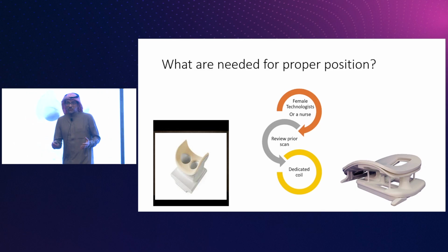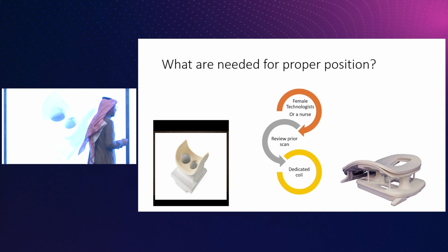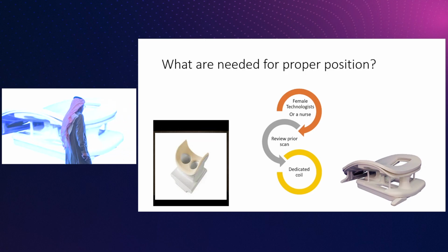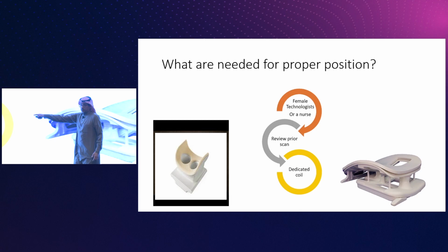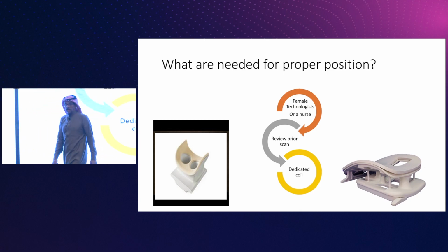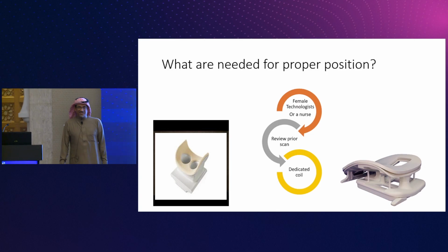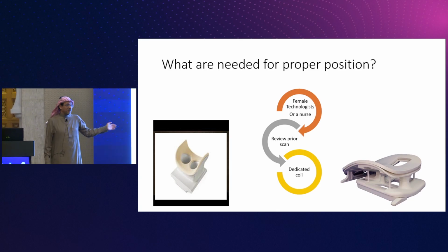When there is a patient for positioning, you need to look at the breast from the side and from the head. Okay? And with the other model here, you cannot do that when you put the patient down. That's why it's not preferable. Sometimes the companies give it to you free because they know that you will not ask for it.